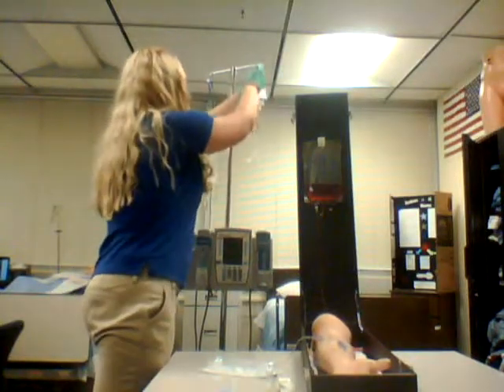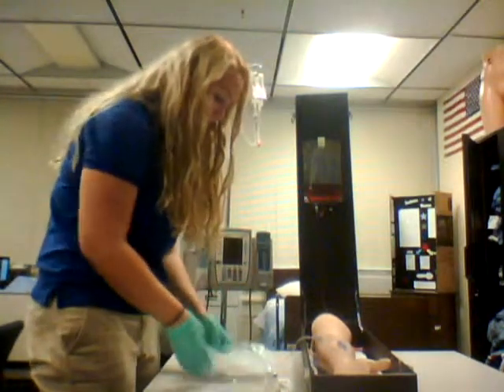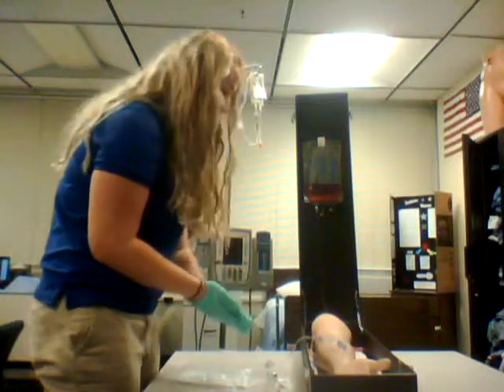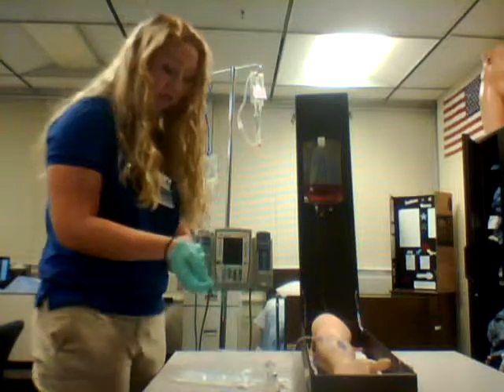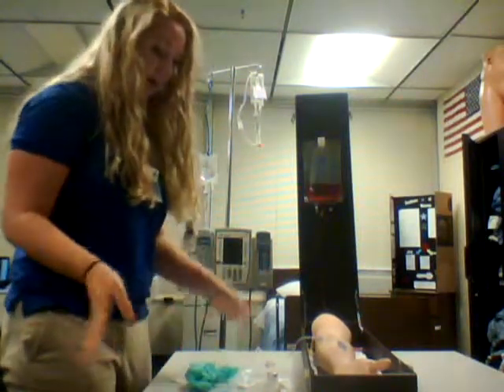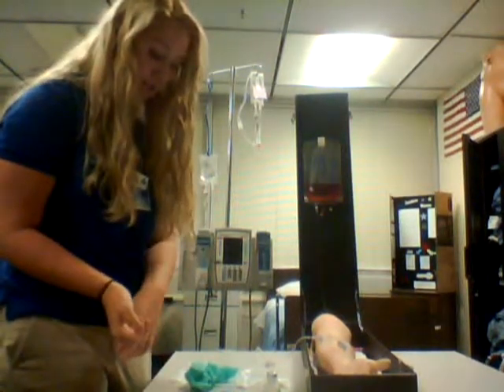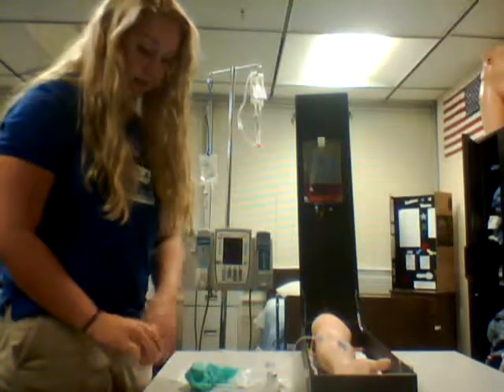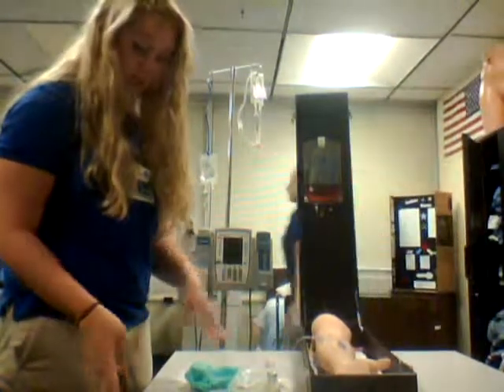Okay, Ms. Pinter, are you feeling okay? And again, I'm going to observe the site for any infiltration or phlebitis and medication reaction to the primary line. I don't see any rash. And I'm going to remove my gloves. I also don't see any redness. I'll take out any supplies that I had, throw it away, and I'm going to document the medication that I used, the time, the drug, the dose, and the route, the condition of the IV site, the volume of fluid used to deliver the medication, and the I's and O's.